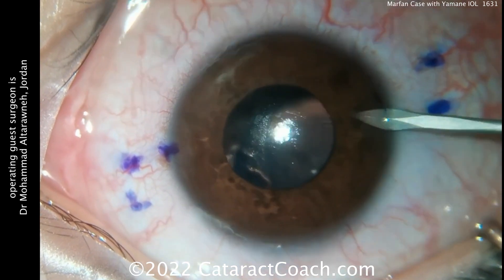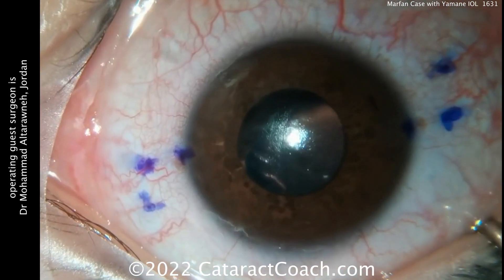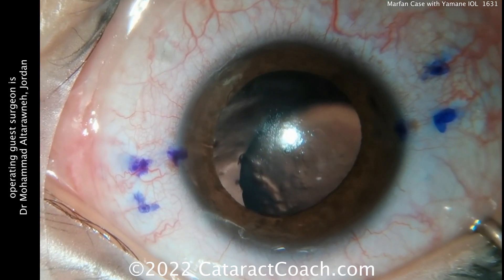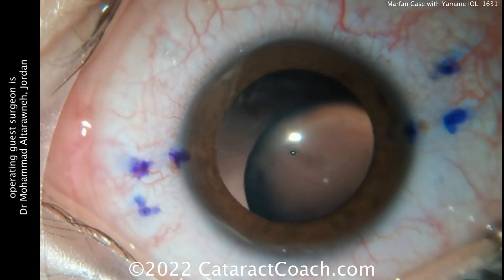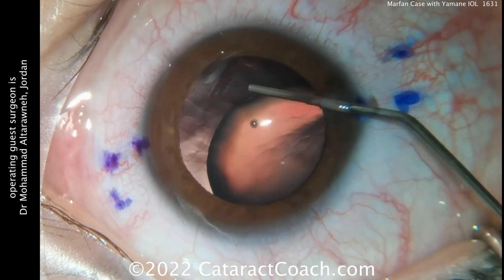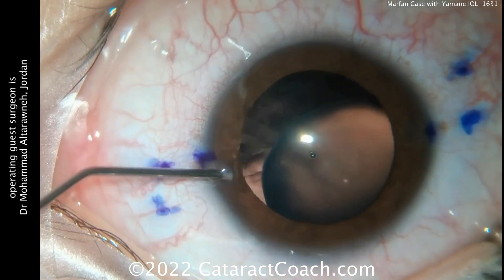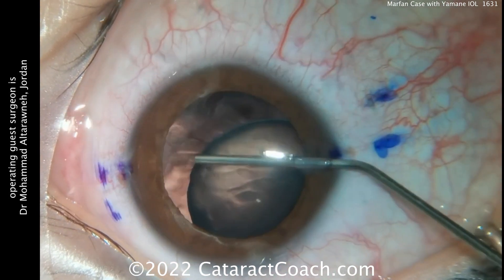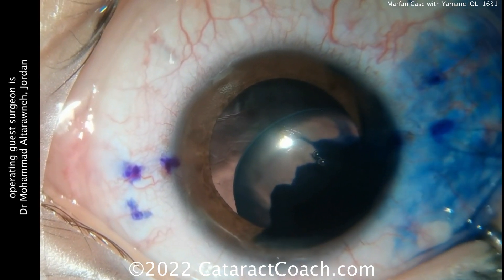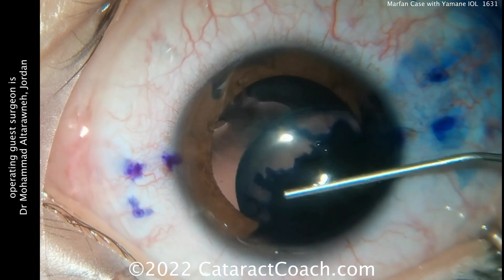Those marks are two millimeters posterior to the limbus, and then those two marks on either side are about two millimeters away from each other. As the pupil dilates, look at that dislocated crystalline lens. The patient is probably pretty young — you can see there's no lens opacity, but there's really an absence of zonular support for at least 180 degrees, and with that much displacement of the nucleus, probably even more.